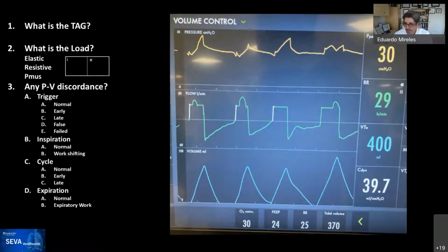So I would ask, is there anybody that wants to give it a try at reading it in order, and then we'll dive into the targeting scheme. Again, this is a safe space. We're learning, and every time we learn a little bit more. Are any of our fellows interested in jumping on it? All right, Samir, go for it.